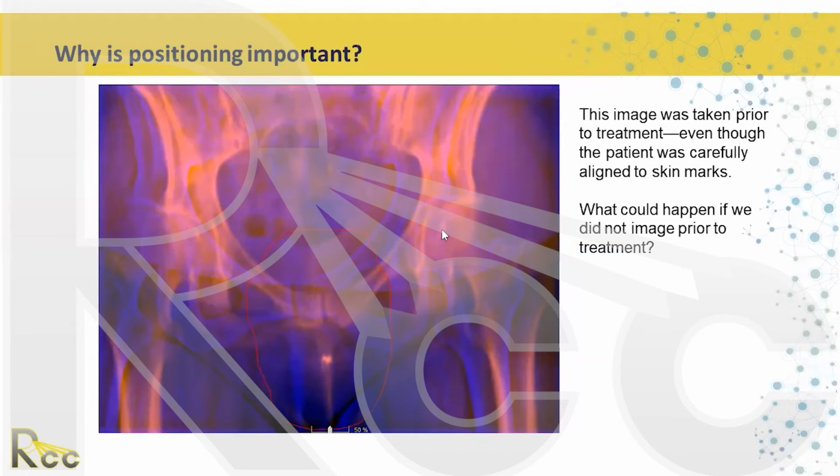And also, we always film all of our IMRT patients daily, and this is one of the reasons why. Something can look on, but when you actually film, it's pretty off. So if this was a 3D plan, you'd probably have a significant amount of margin and it wouldn't be as big of a deal.